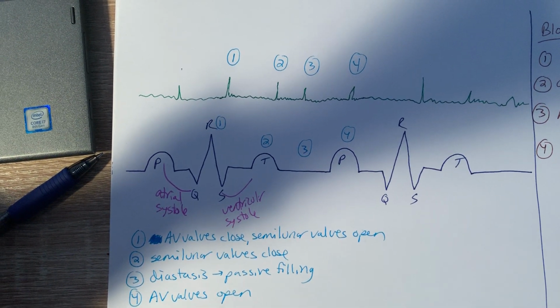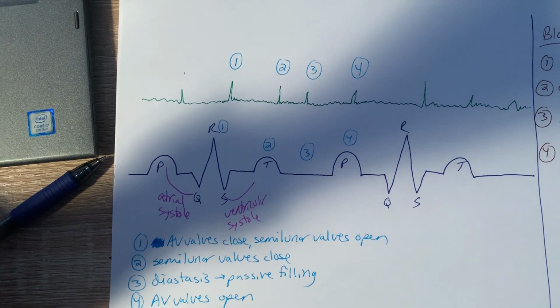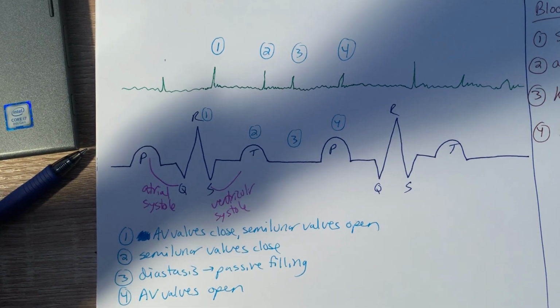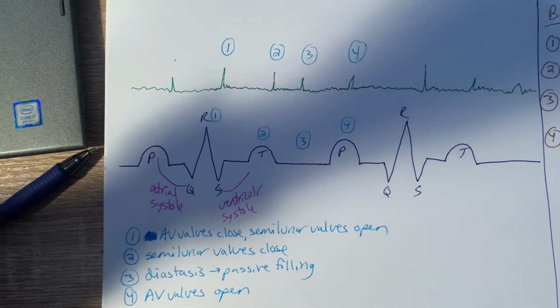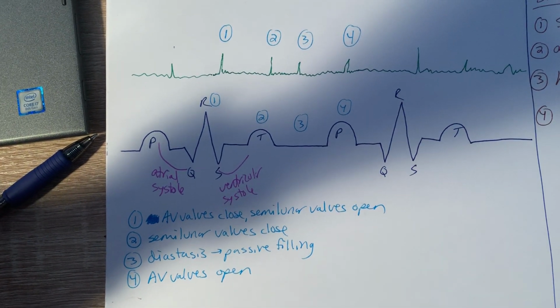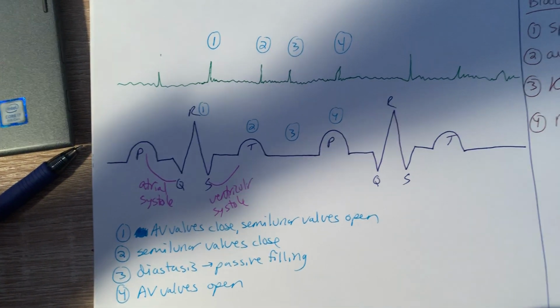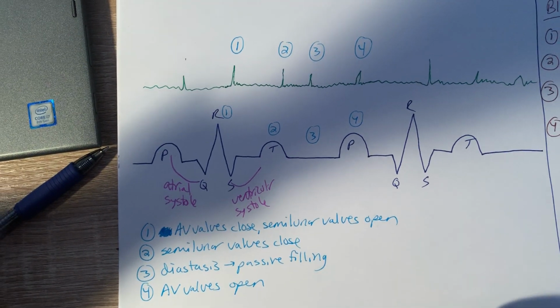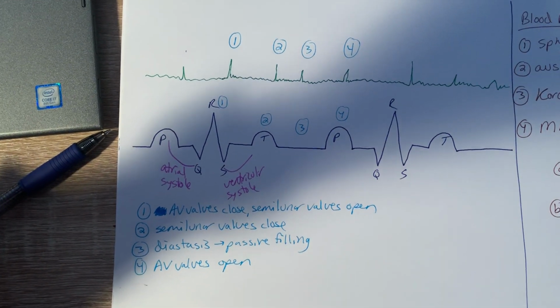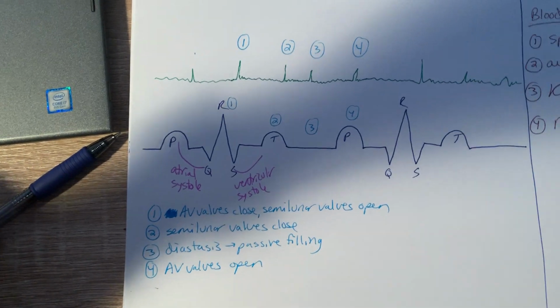Okay, guys, so today we are going to be talking about blood pressure and we'll be looking at heart sounds also. If we were in class, we would be measuring these things using the blood pressure cuff, which is called a sphygmomanometer. I'll go over that in a minute. And we would be hooking ourselves up to the BioPAC carts, but we're not in class, so we're not going to be doing that today. We'll be just doing it this way, which is fine.